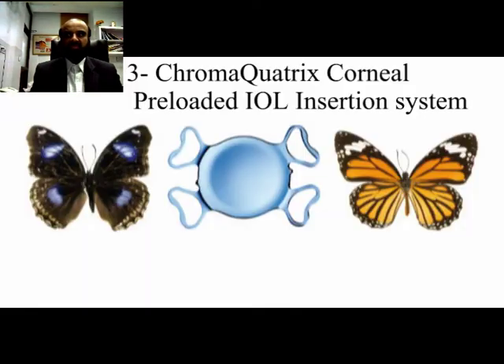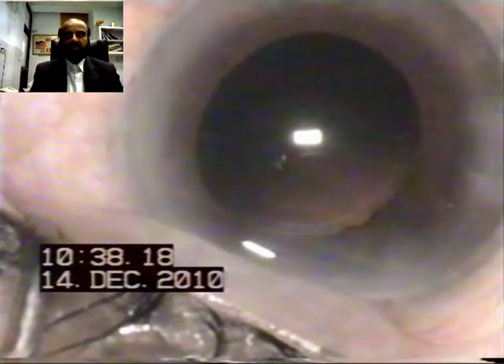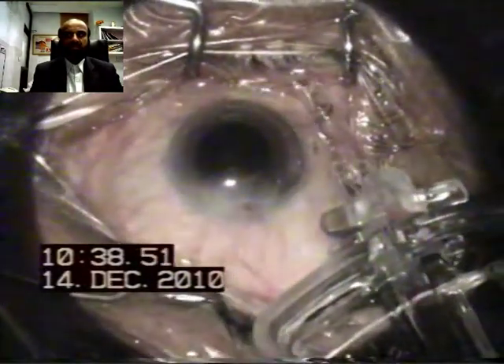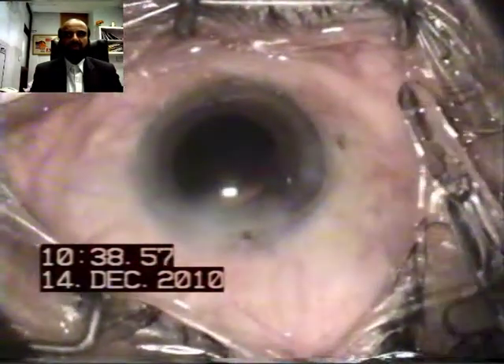This is a summary of the steps. Now we come to a truly preloaded IOL system. The whole assembly comes blister-packed and there is no need to assemble the cartridge and the plunger — it comes in one piece. There is only one lock which needs to be pushed on the lateral side of the cartridge, and then you gently push the plunger and the IOL is placed in the nozzle.